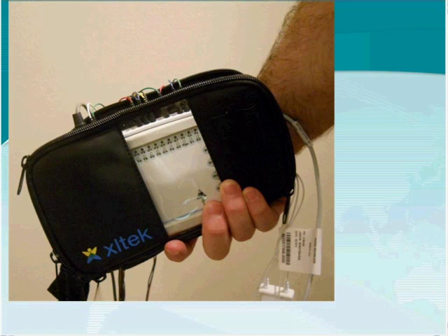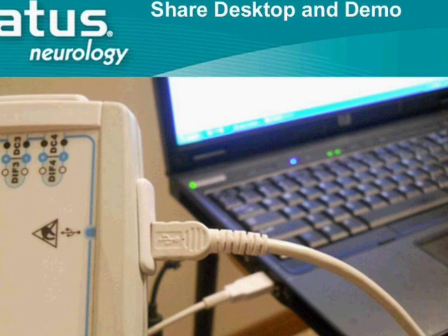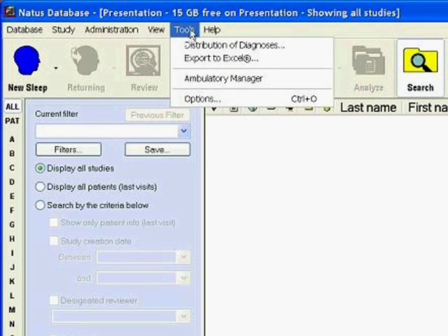The carrying case can be connected to your belt, and there is also a lanyard cable you can wear around your neck. There is a small pocket in the front where you can store extra batteries. Right now, my Trex is being powered by external power connected to my laptop. I am going to share my desktop now. When using a Trex amplifier, there is a separate software module to manage studies called the Ambulatory Manager, found under Tools.